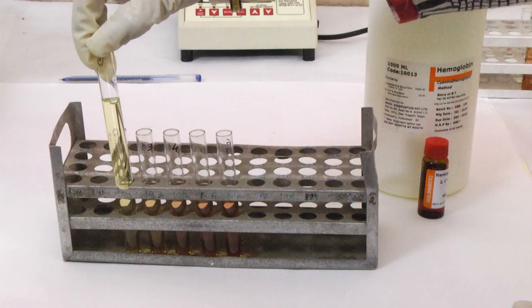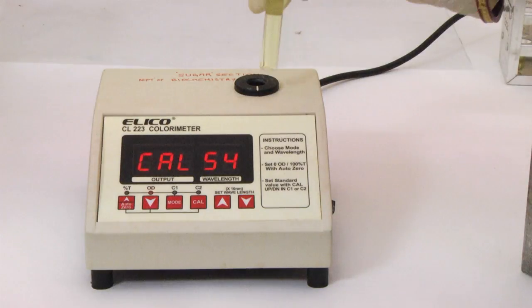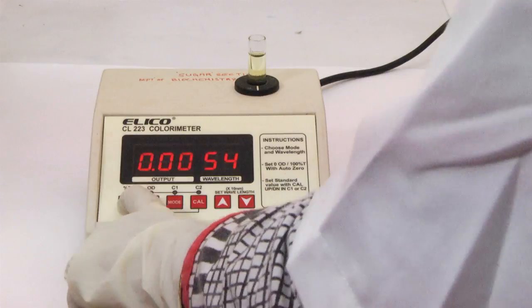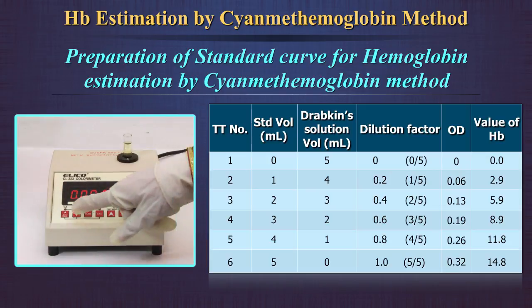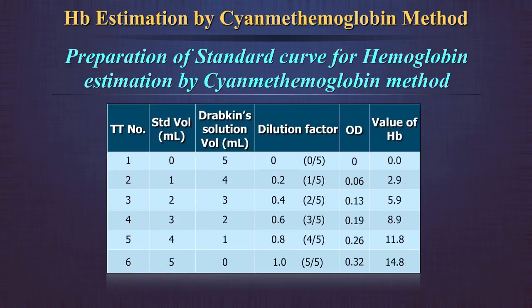Take the test tube with neat Drabkin's solution and transfer it to the cuvette. Place the cuvette in the spectrophotometer and set the OD to 0 at a wavelength of 540 nm. Now measure the OD of each dilution in the spectrophotometer against the blank of Drabkin's solution, taking a clean cuvette for each dilution. Record the OD values in a table.